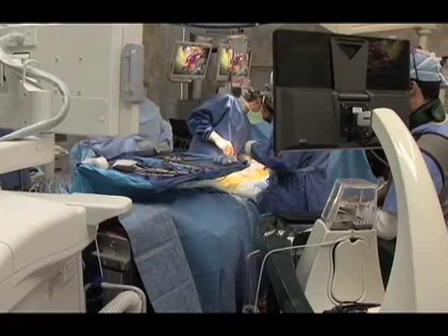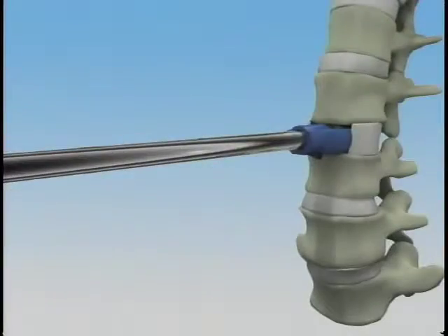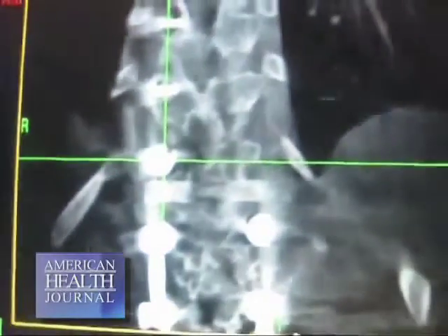Then we can bring a tool into the field. This is simply a pointer, but we can also have other tools such as a drill for a bone screw, or the tap, or the actual screw itself, or different types of implants, such as a disc replacement implant. We can bring them into the field, and with these reflectors, the position is captured by an infrared camera. It's a double lens camera. So it knows where this is in relationship to this, and it knows where all the anatomy is relative to this. So therefore, the computer tells us where this is pointing. So we know exactly where to make a small incision, and that allows us to insert tools and devices, implants, screws, or spacers, through much smaller incisions and much more precisely.